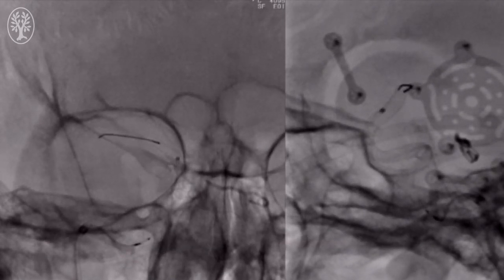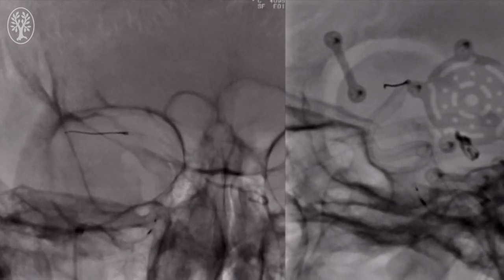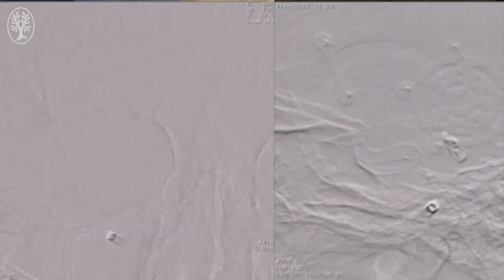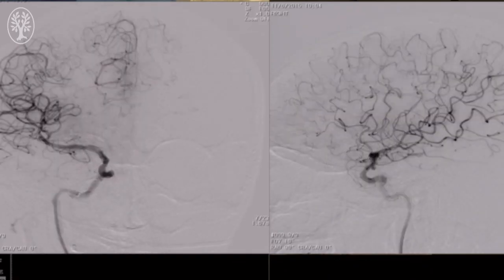The microcatheter is advanced to recapture the distal end in the proximal right middle cerebral artery. Both microcatheter and delivery wire are withdrawn. An angiogram confirms excellent wall apposition in the horizontal segment and distally, with apparent stasis in the PCOM aneurysm.